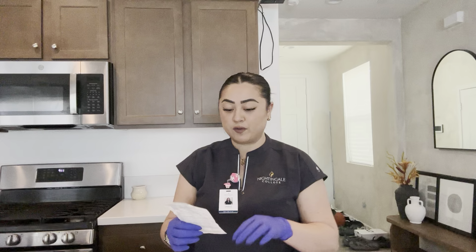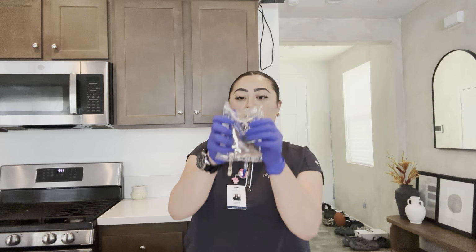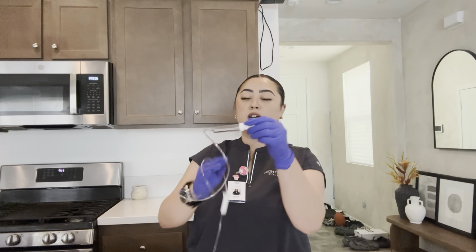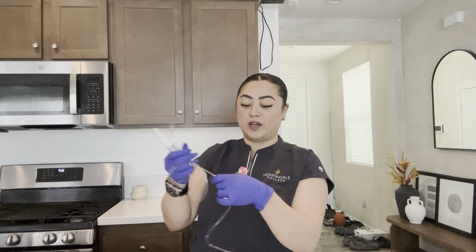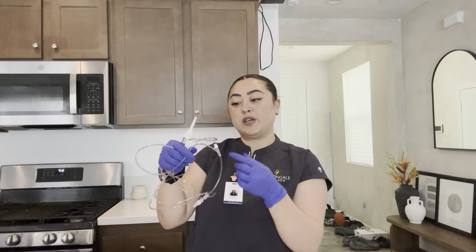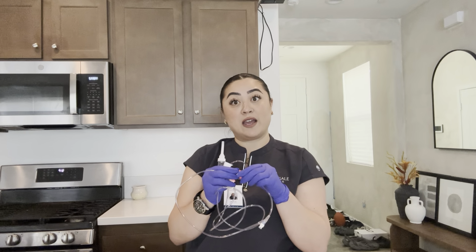And then let me just go over my supplies here really quick. So I have my primary one here, and it shows on here the drop factor as well. So I have my primary bag. This is the normal saline. I have my IV tubing here. This is the spike right here. This is the chamber. Here's my clamp so I can control the drop factor. Right here is the Y tubing, where we can also administer medication as well while we're running fluids. And then right here is the adapter, where we would hook up the IV.